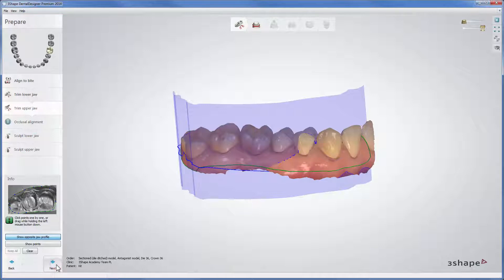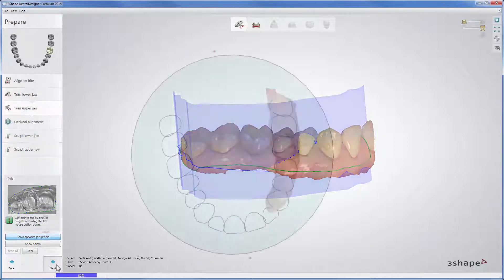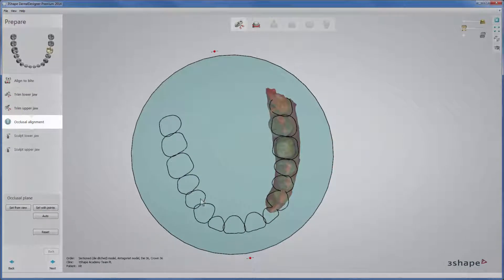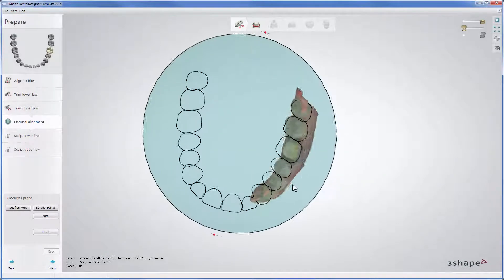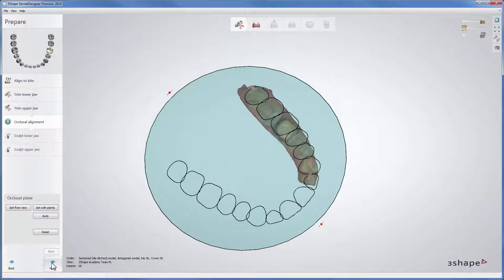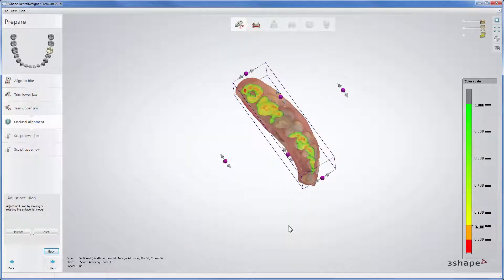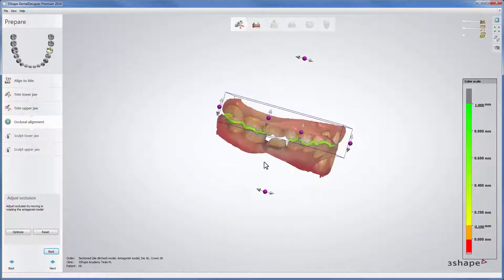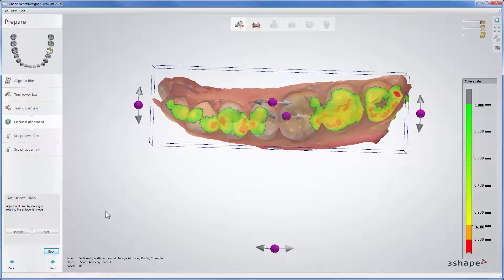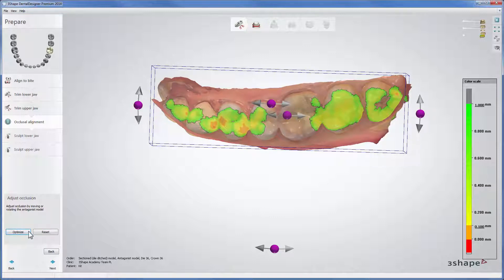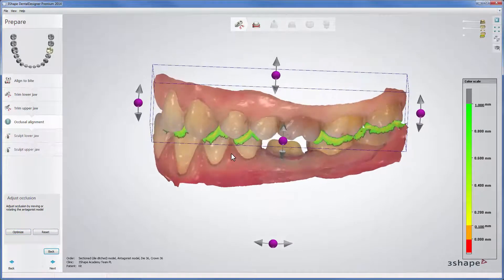Click Next to proceed. The Occlusal Alignment step allows you to set an occlusal plane by moving and rotating it. Once set, accept it by clicking Next and start adjusting the occlusion. Move or rotate the antagonist model if necessary. Use control points or click the Optimize button to correct the occlusion automatically. This functionality is particularly useful if the patient did not bite properly while the bite scan was made.